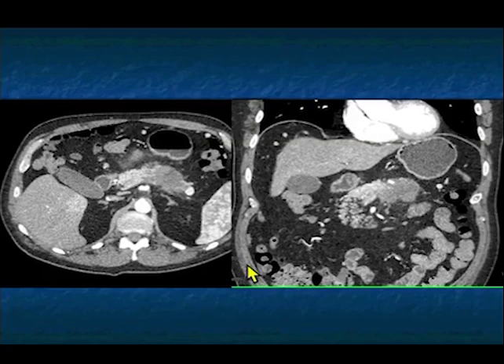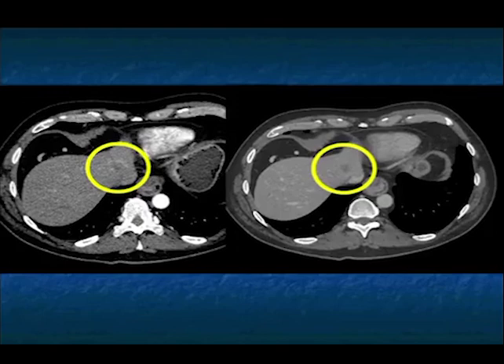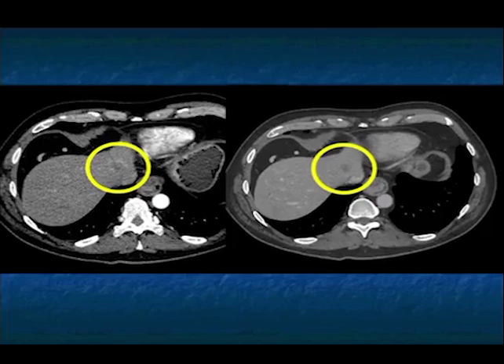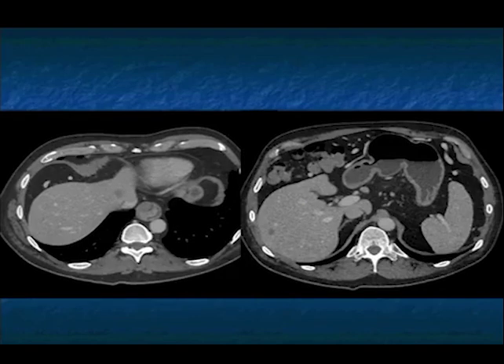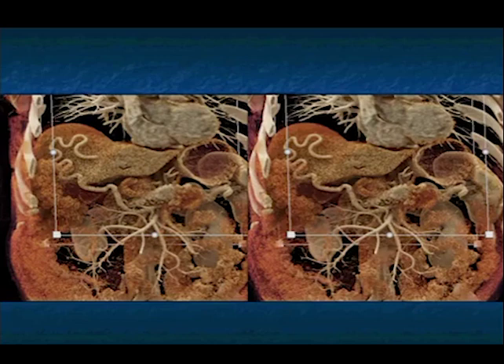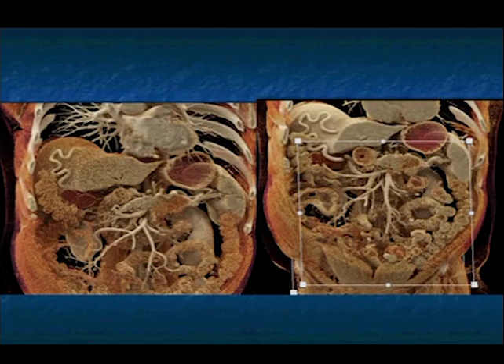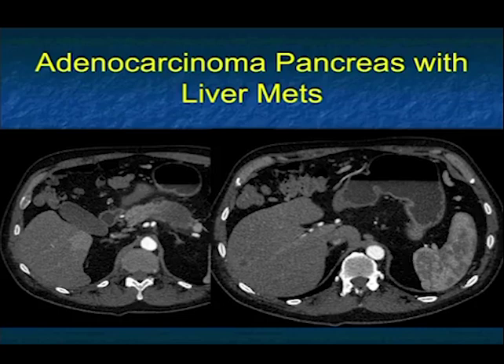You can see a mass in the body of the pancreas. This patient has a perfusion change in the liver, and in addition to the pancreatic mass, has liver metastasis. Liver metastasis can be small. The reason this is a mass and not a cyst: its borders are poor, and on arterial phase imaging you see increased enhancement around the lesion. The patient has multiple liver metastases, making the patient unresectable. It's very important when staging pancreatic cancer to look carefully at the liver — look at vessel involvement and make sure you're not missing any liver mets.